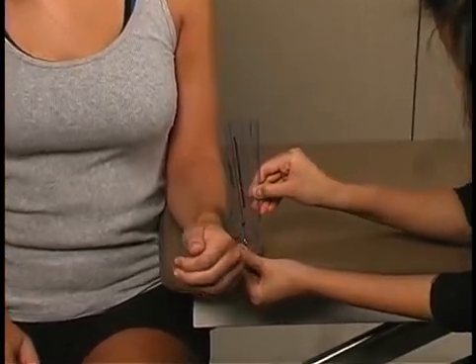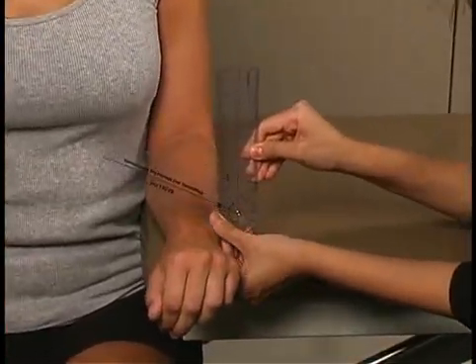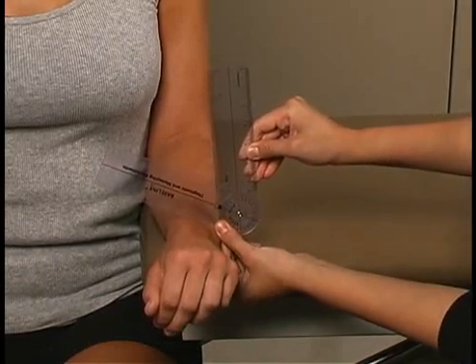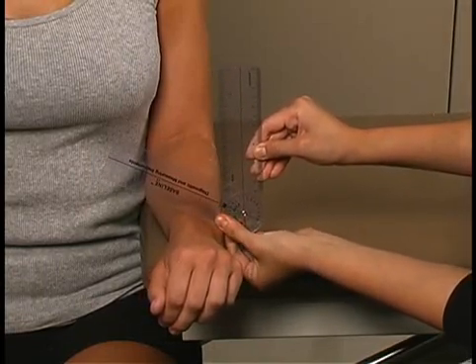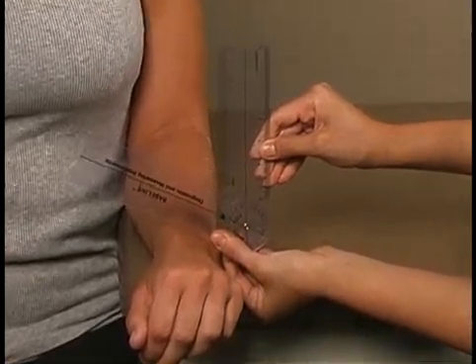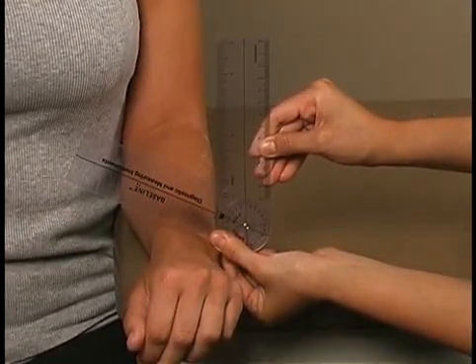Now move your palm down, hold it there. Thank you.